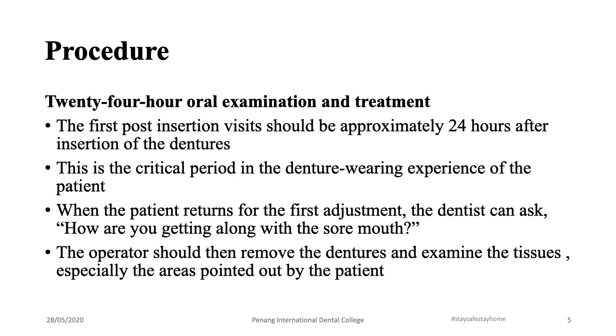And always remember to tell the patient before coming to the appointment that they have to wear their dentures for the next 24 hours and then come back. The reason being, during this period, wherever the impingement or the pressure is taking place, these leave sore spots on the oral tissues, which makes it much easier for you to trim.